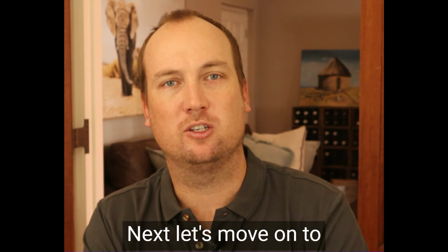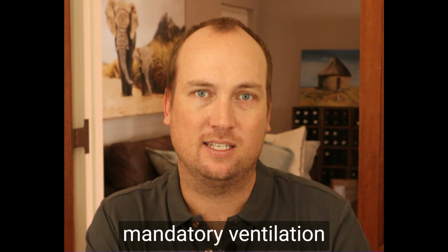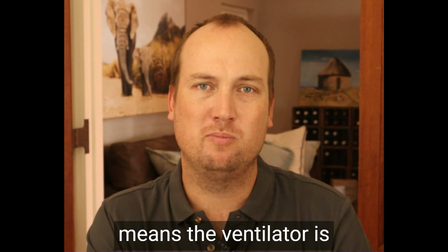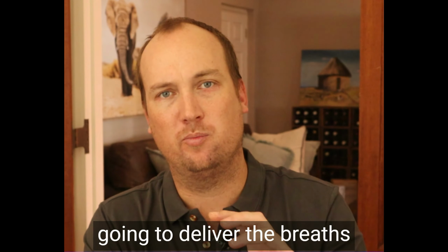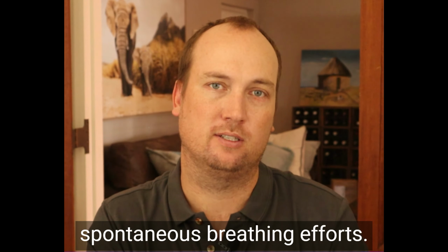Next, let's move on to pressure-controlled ventilation. So this is also a form of mandatory ventilation by the ventilator, which means the ventilator is going to deliver the breaths irrespective of the patient's spontaneous breathing efforts.